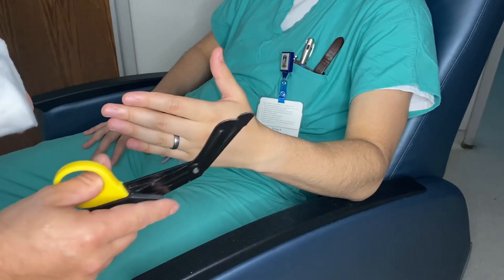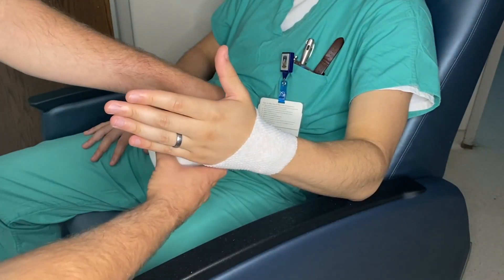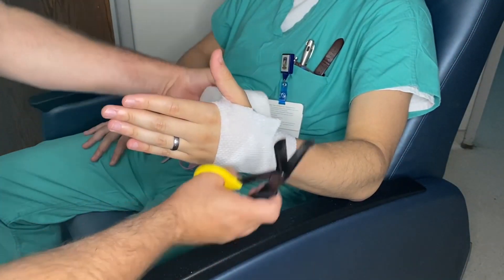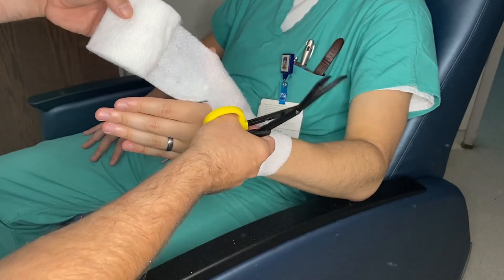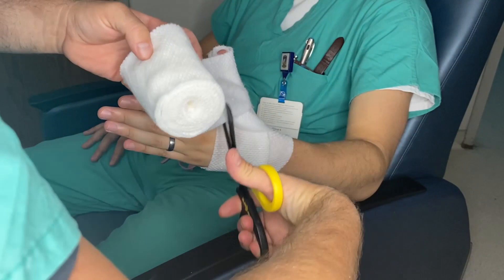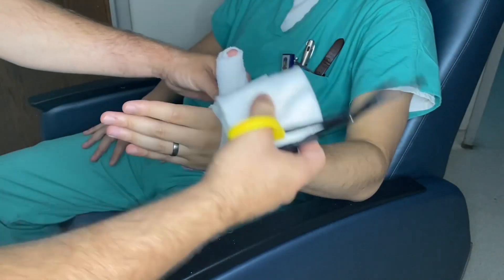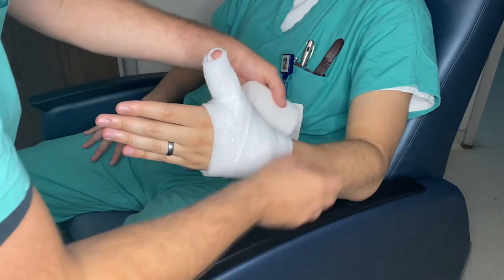Now I'm going to talk about the technique for rolling around the thumb when doing a thumb spica. Start at the wrist, go all the way around the hand, and do a three-quarters cut cutting away from the patient. Go all the way around the hand again and then around the thumb. Cut right at the MP joints, just a quarter cut, then wrap nicely around the thumb three times. Go back around the hand, then around the MP joints again with a three-quarters cut away from the patient, capturing all the material you already cut, then go down 50-50 for the rest of the splint.